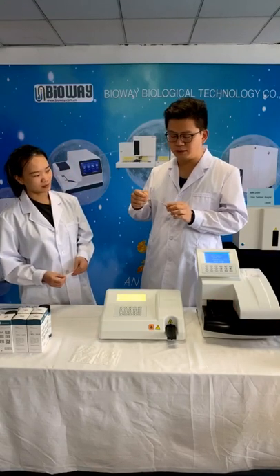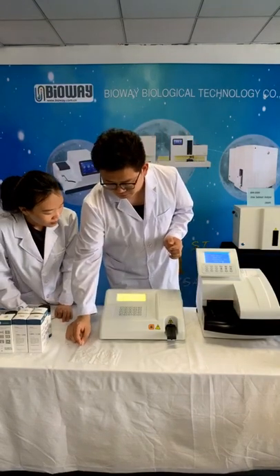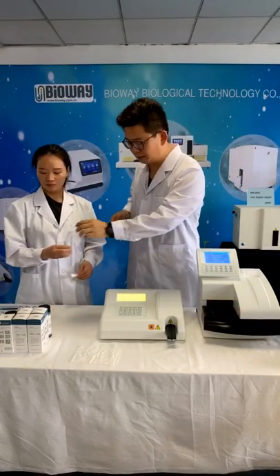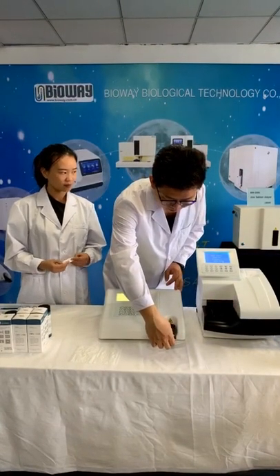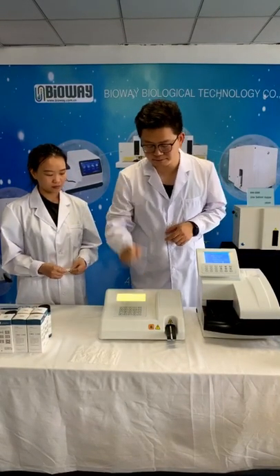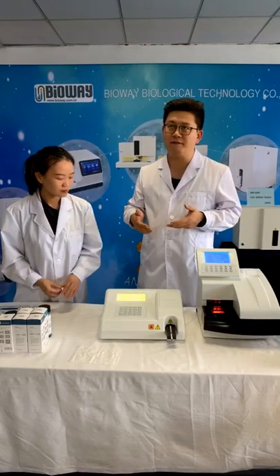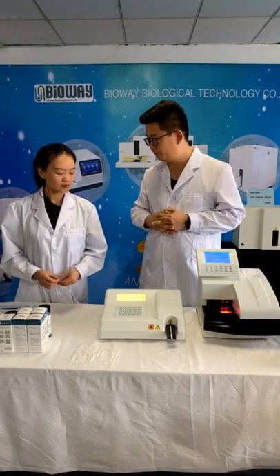Insert the urine strip to make sure all the testing pads are in contact with the liquid. And put the urine strip into the slot and press start. And we have to wait approximately 35 seconds for the chemical reaction.